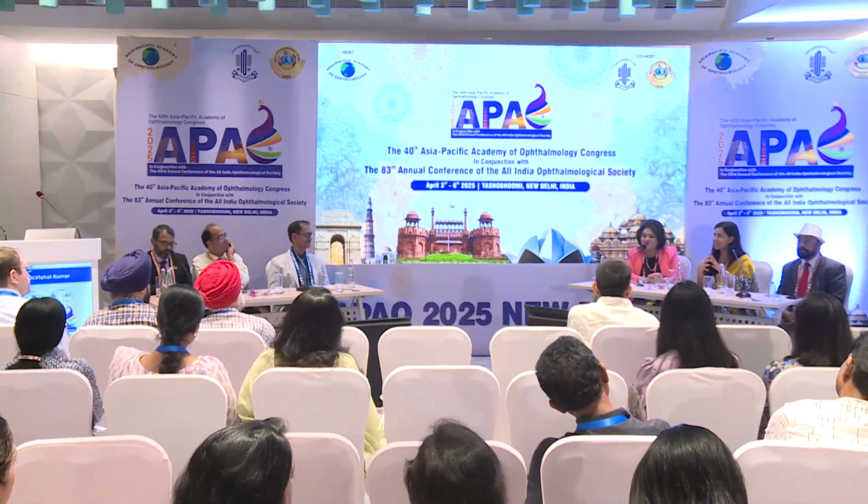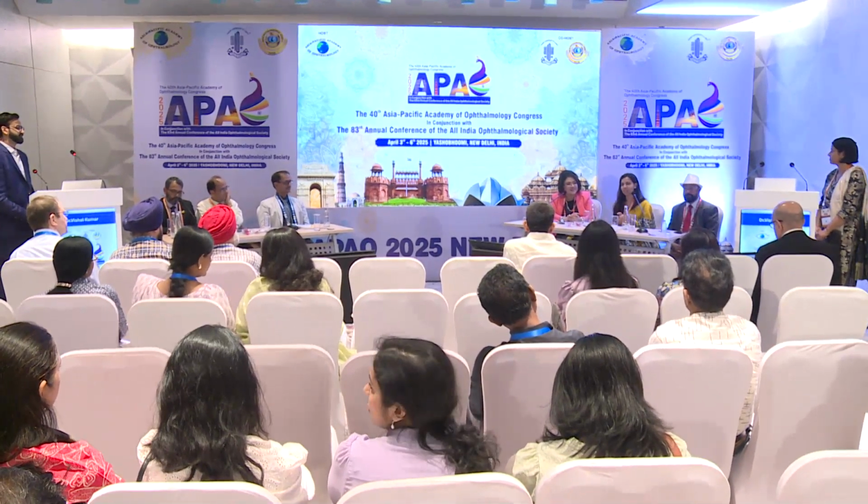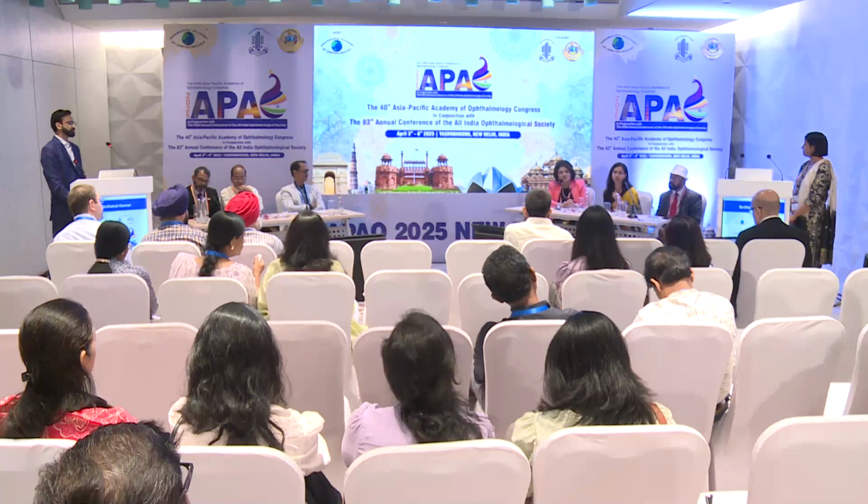Right, great talks, both of you, and they're very nicely put together cohesively on where you should or should not do a toric IOL in KC, and my job is just to bring it into perspective. The first thing, very easily, we are talking about aberrations and irregular astigmatism, so many things where a toric IOL may not be the best.